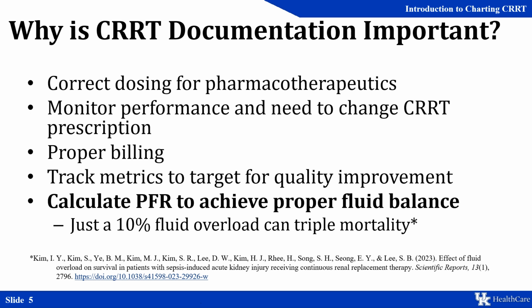Lastly, and perhaps the most relevant reason to you as the bedside nurse, is to calculate the patient fluid removal we need to pull to achieve a proper fluid balance. Many patients on CRRT come in with some degree of sepsis. A patient with a 10% fluid overload with sepsis can triple their mortality. After all, we need to resuscitate the patient in the beginning, help them survive the initial insult, but in order for their organs to function properly, we must eventually reduce their fluid overload.